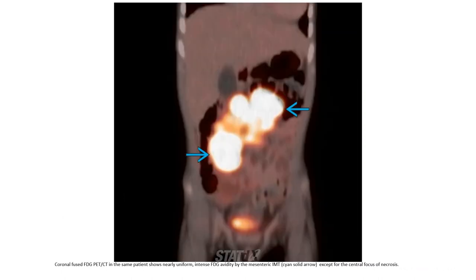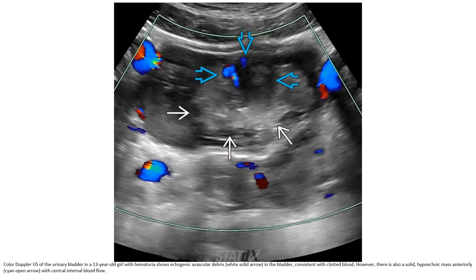Axial FDG PET in the same patient shows nearly uniform intense FDG uptake throughout the mesenteric IMT, except for the central focus of necrosis.